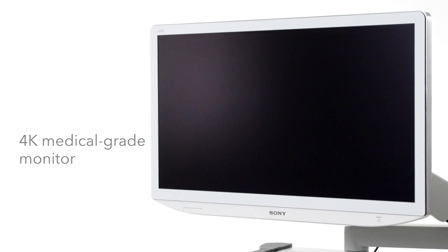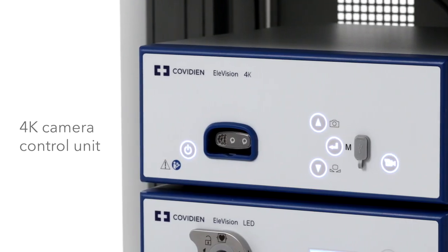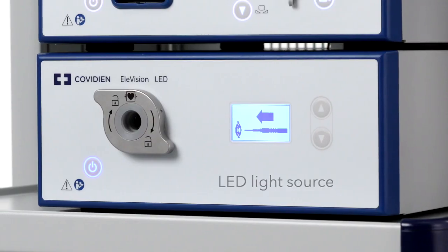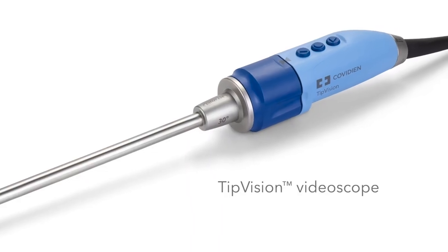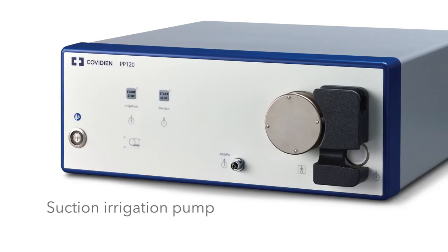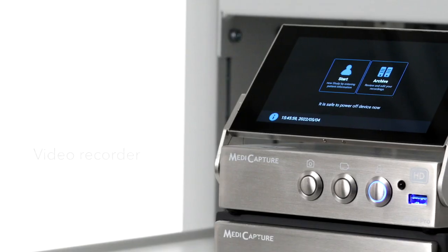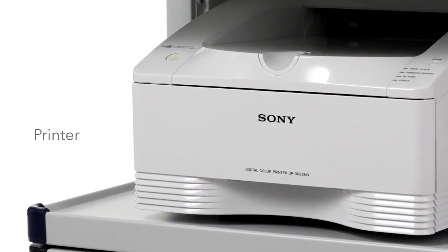Many components are available to use with the 4K Plus platform: a 4K medical grade monitor, the 4K camera control unit and camera head, the LED light source, tip vision video scope, 4K laparoscopes, and the insufflator. The Elevision 4K Plus platform also includes a laparoscopic suction irrigation pump, a video recorder, and a printer that you can add to your tower as needed.